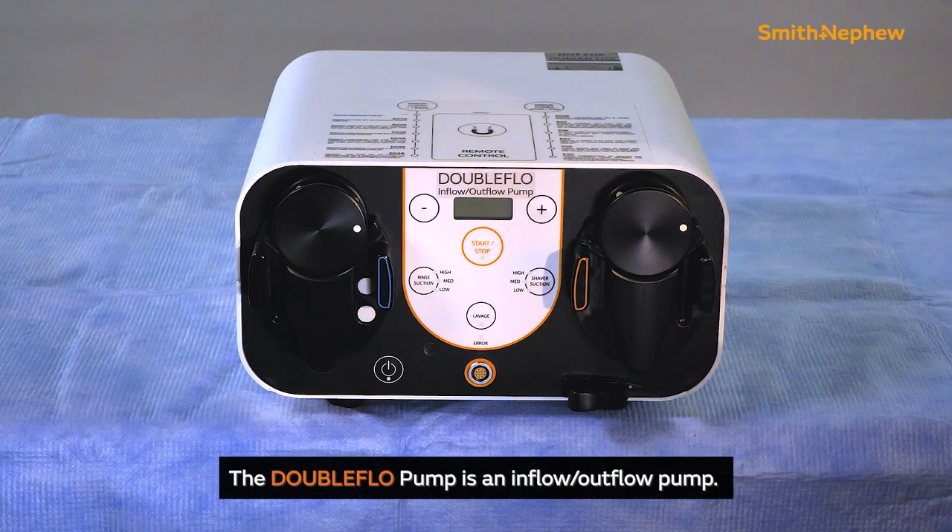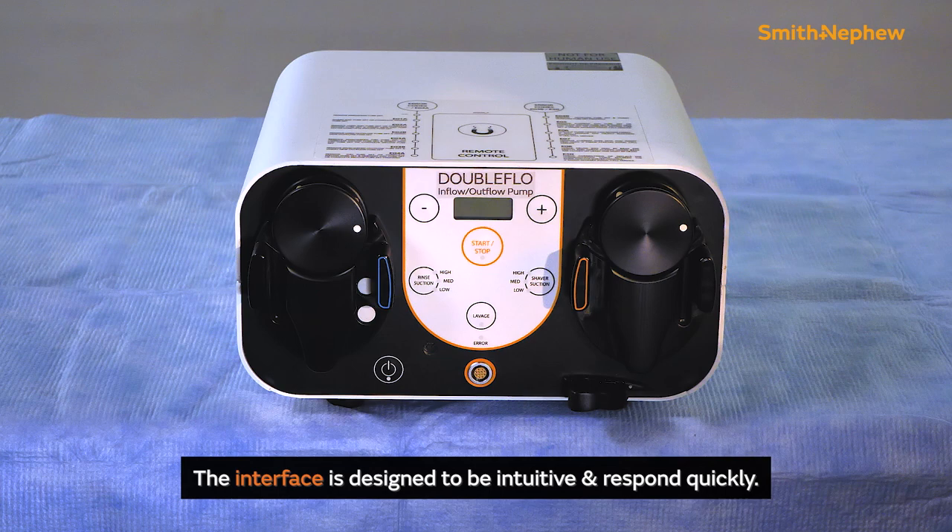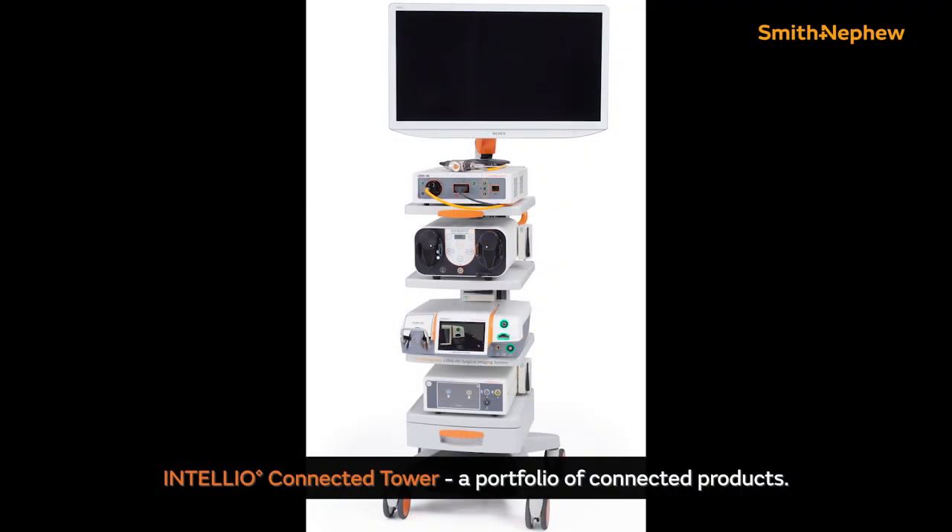The DoubleFlow pump is an inflow-outflow pump designed to enhance simplicity, responsiveness, and connectedness. The pump interface is designed to be intuitive and respond quickly to surgeon needs in diverse clinical situations. Further, it is part of Smith and Nephew's Intelio connected tower, a portfolio of connected products to streamline and optimize arthroscopic needs.